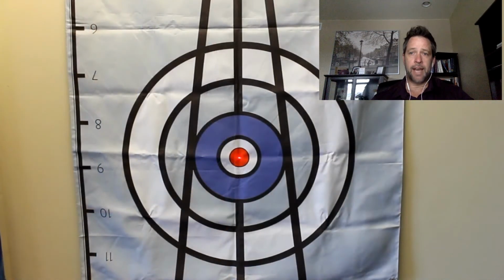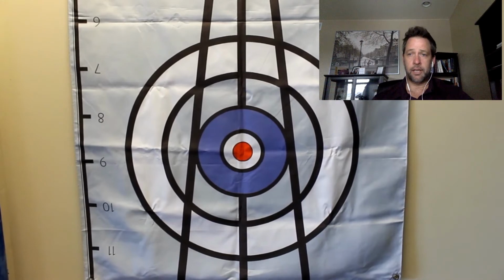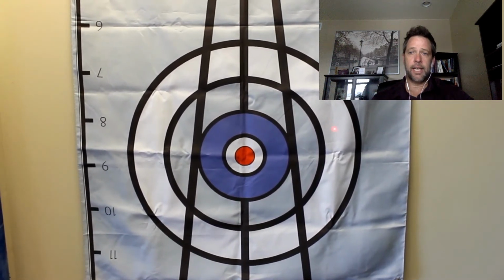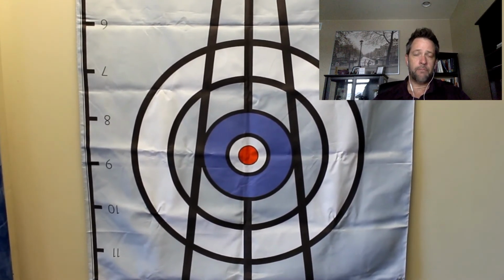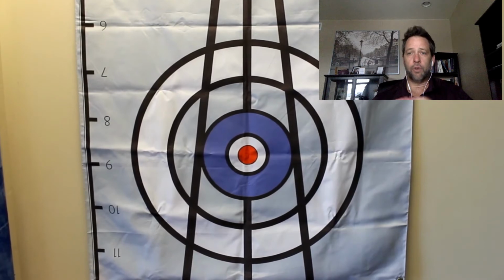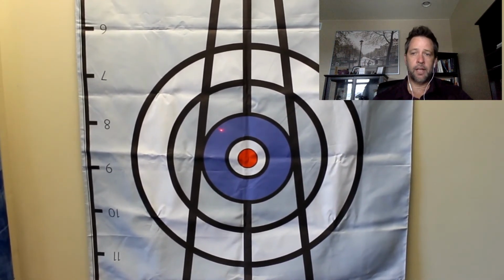During those repetitions, you note whether the laser is inside the standard deviation or it's not. So it doesn't have to be bullseyed. If it's going to be outside the darkness of the dark blue area, that's going to be outside the standard deviation. If it's anywhere inside that deep blue field, including the bullseye, then it's inside the standard deviation. So we're not necessarily looking for how tight the cluster is, just whether it's a positive or a negative.